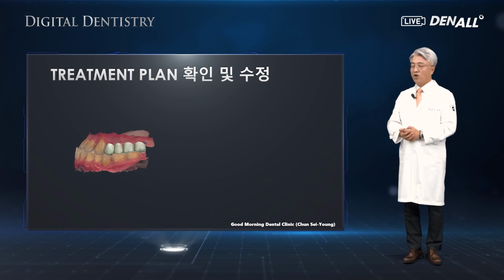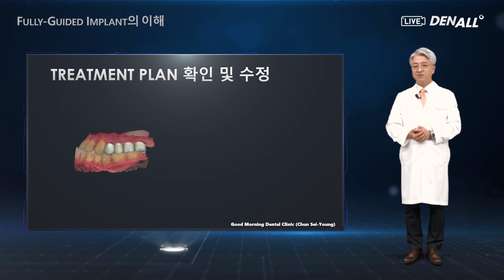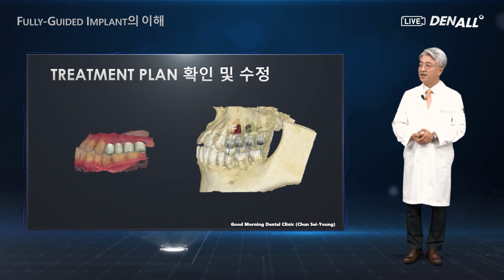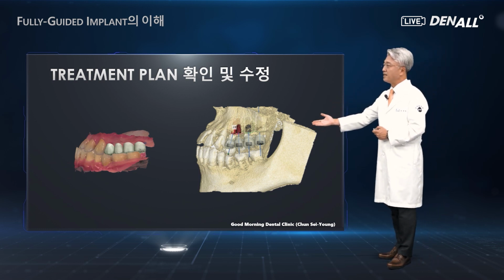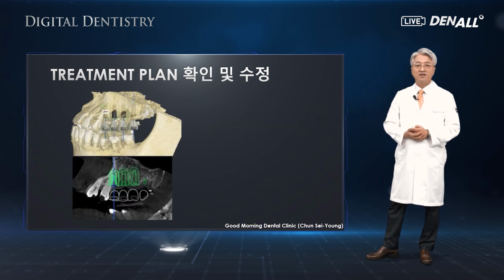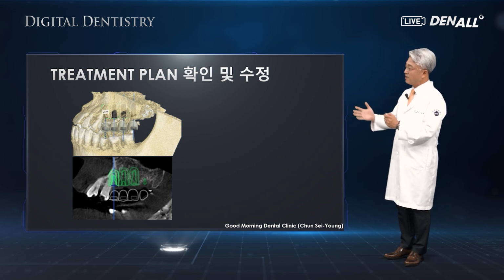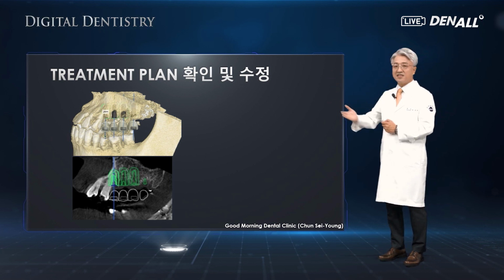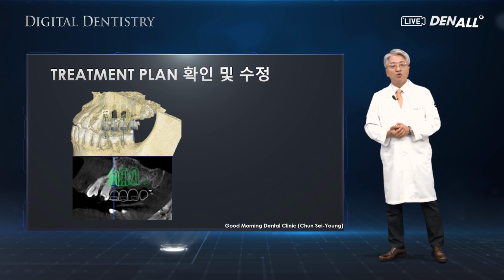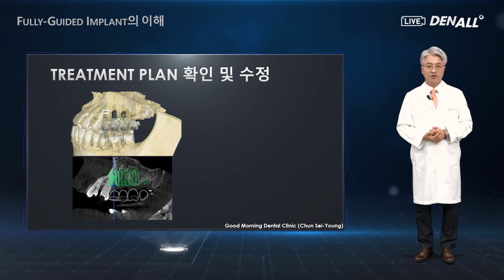During the implant planning, this can be very helpful as well. In this patient, we plan to place 4 implants, and the surgery was planned. And during the simulation, as you can see, the implants are positioned at each tooth place, and there's interference between them. Therefore, they were corrected to be in parallel with each other. Number 24 fixture is interfering with the root of canine in this simulation.